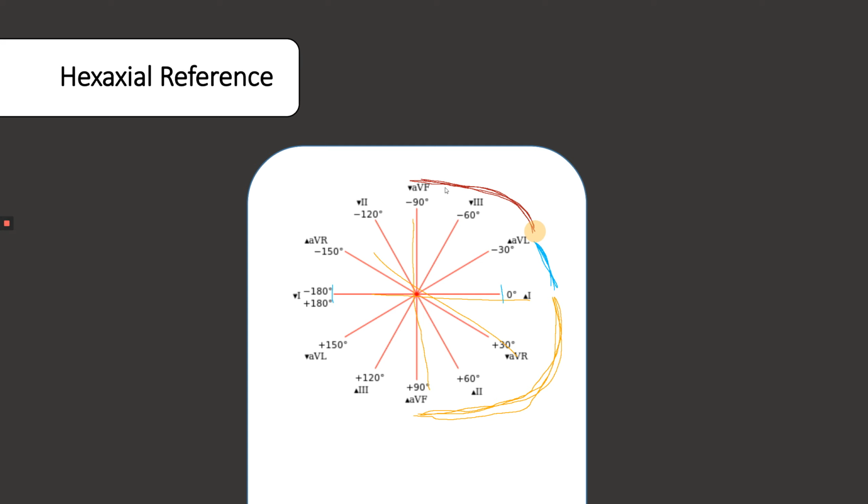So we're looking there at pathological left axis, and then down here, starting at 90, going up to 180, we've got right axis deviation. Now, there's no pathological or physiological difference here. It is just right axis deviation. It's pathological in nature.